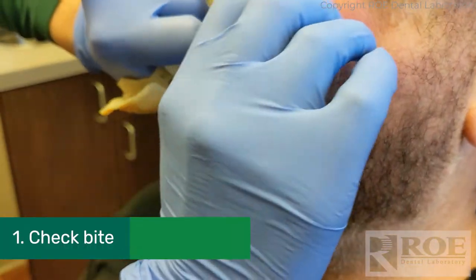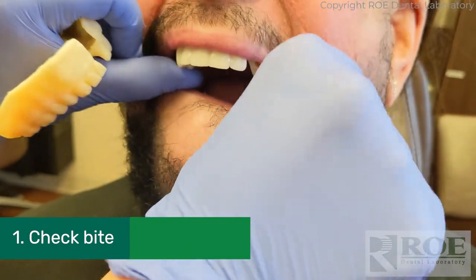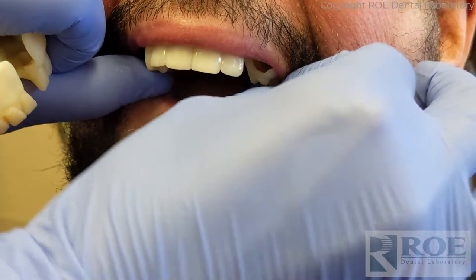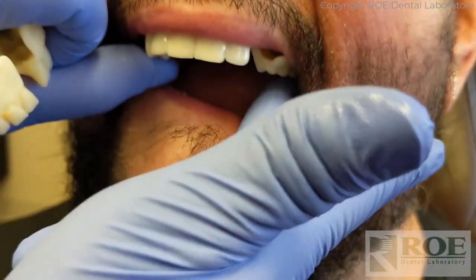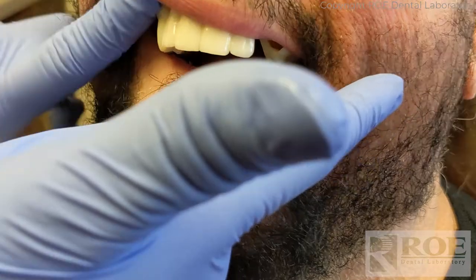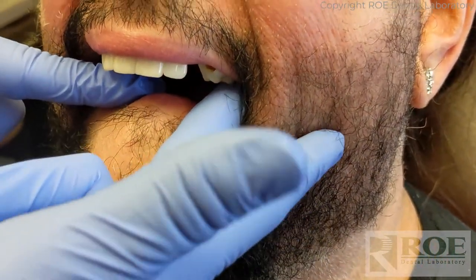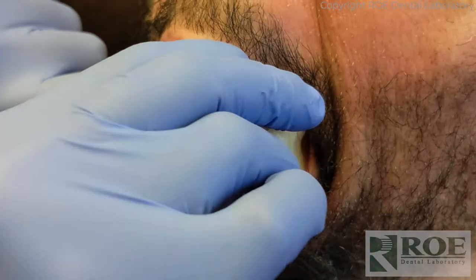If I'm pinching anywhere let me know. All right, so we just want to make sure that they're stable. I think it's mostly tissue contact on this arch, so as long as it feels stable and has a nice positive seat, that's what we're looking for. Feels pretty solid, right? Okay, good. Let's try the lower.